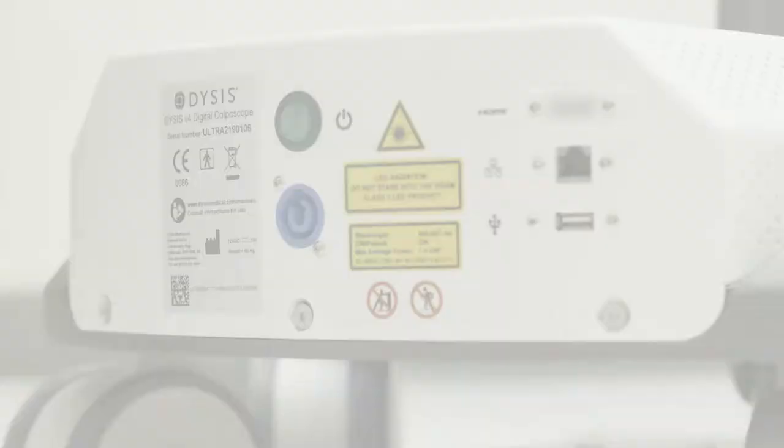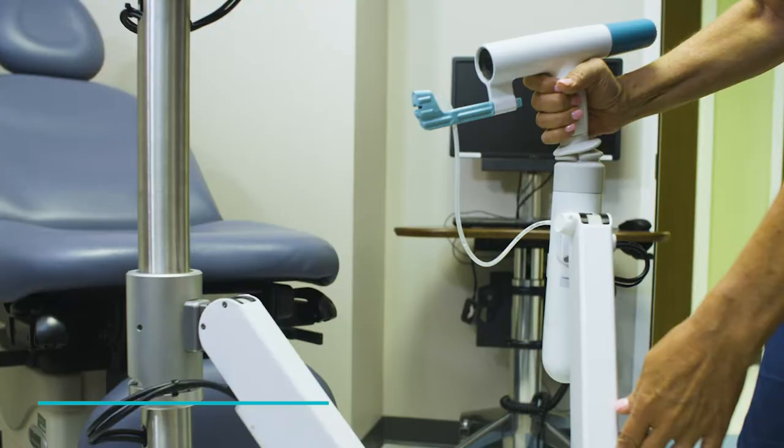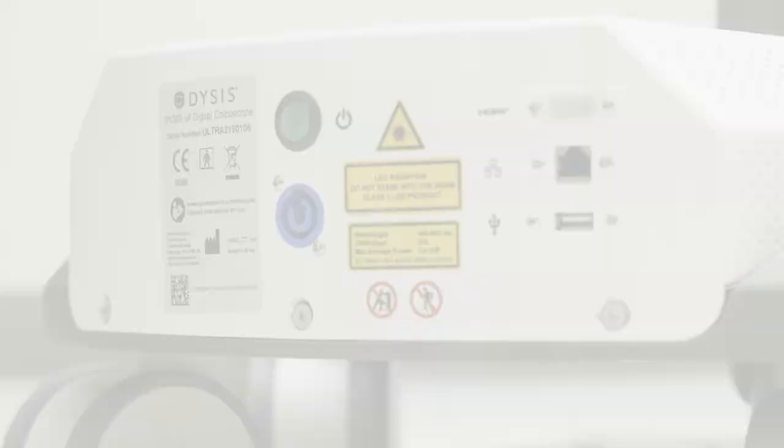Setting up Dysys Ultra for a patient exam. Dysys Ultra includes a computer with all the necessary ports, imaging head, and a touch screen monitor for the provider. To power on, plug the Dysys Ultra power cord into the power outlet and press the green power button on the back of the base to turn it on.